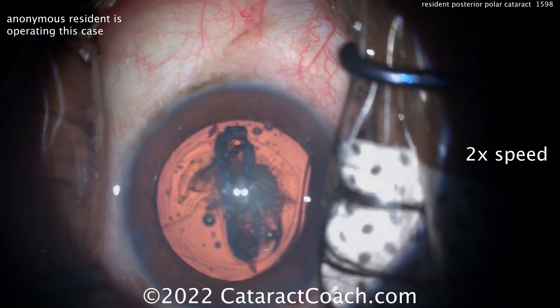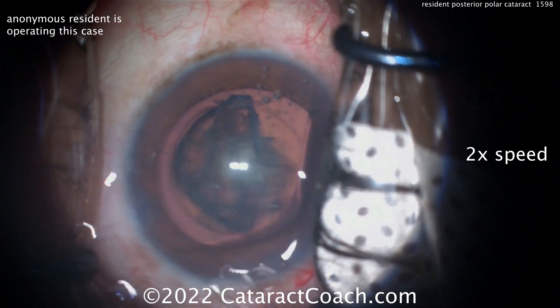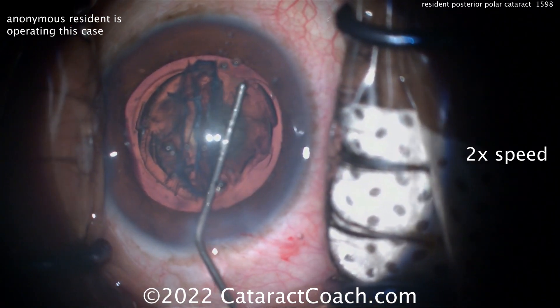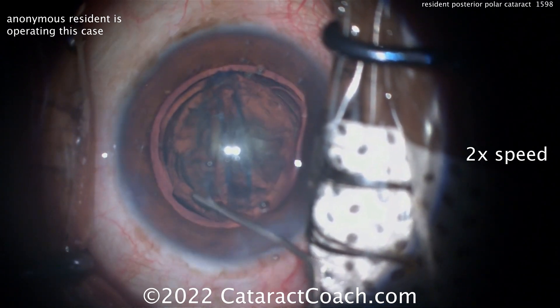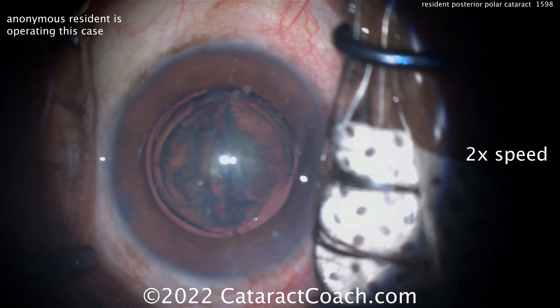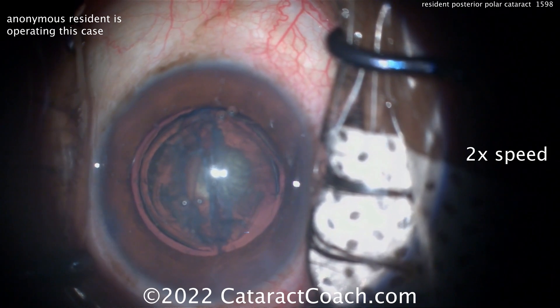A groove was made here centrally, and now maybe there's the hydrodelineation. That's going to be a helpful thing — it's going to help separate that endonucleus from the epinuclear shell. The goal at this point is to get that endonucleus out of the eye, leave the epinuclear shell and cortex behind, and those can then be brought out.